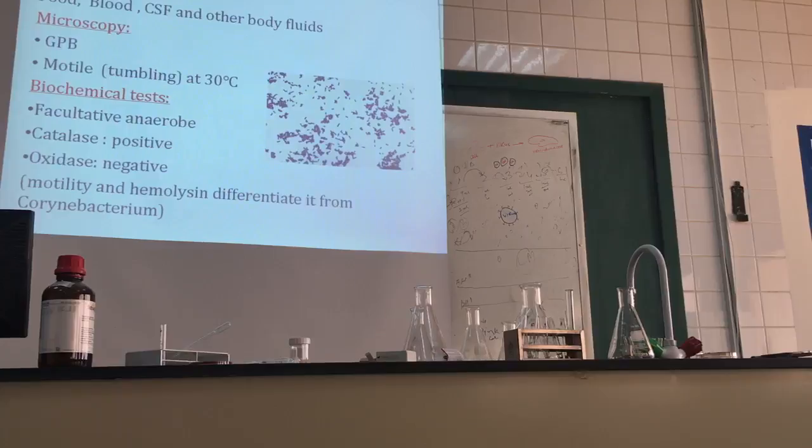What about the last line, motility and hemolysis differentiated? Motility and hemolysin are differentiated from Corynebacterium. I just put it in brackets just for information, because Corynebacterium is not our topic, okay? Just for information.